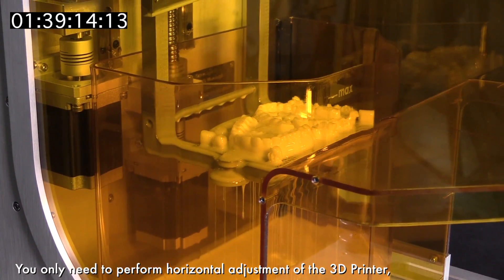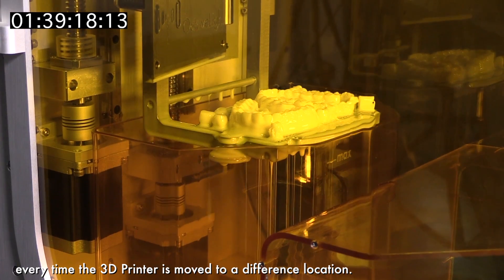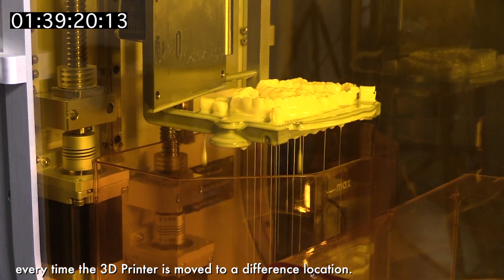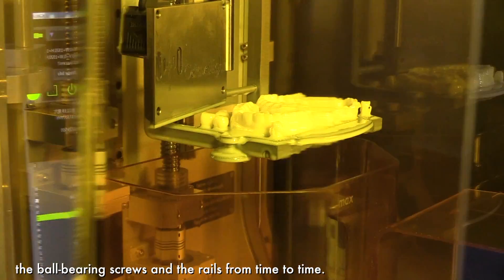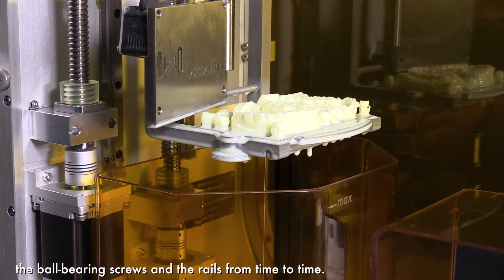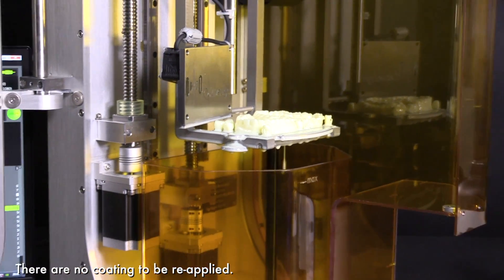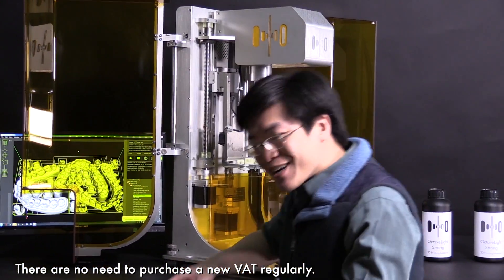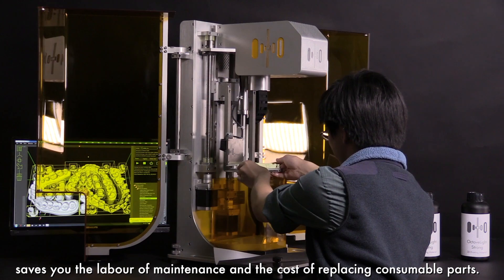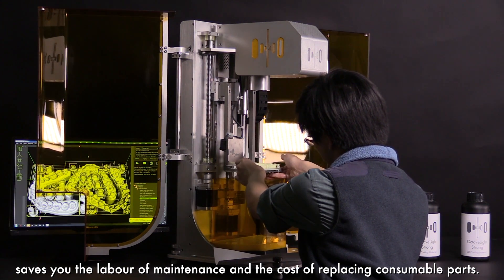You only need to perform horizontal adjustment of the 3D printer every time it is moved to a different location. The only maintenance required is to oil the ball bearing screws and the rails from time to time. There are no consumable parts to be replaced, no coating to be reapplied, and no need to purchase a new vat regularly. Our top-down recoater blade design saves you the labor of maintenance and the cost of replacing consumable parts.